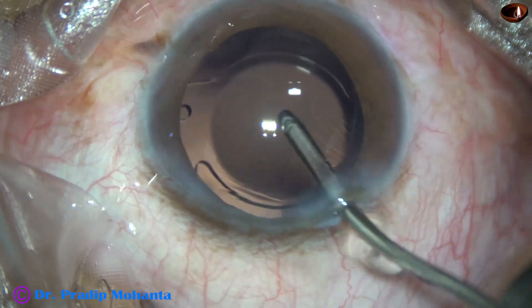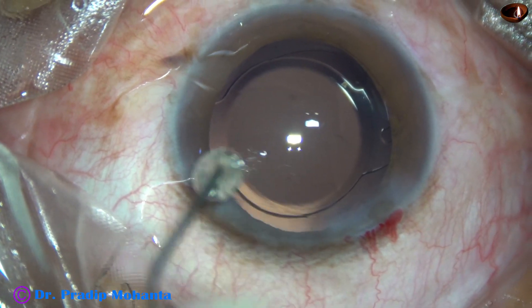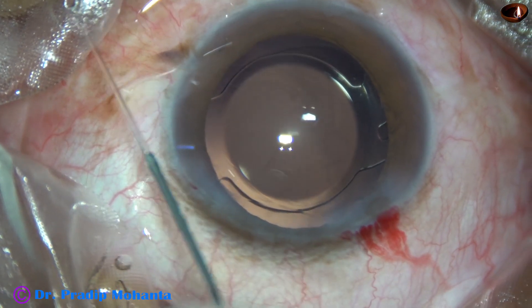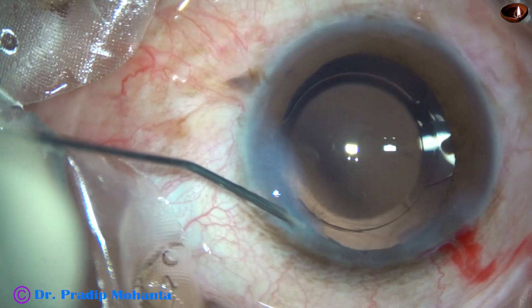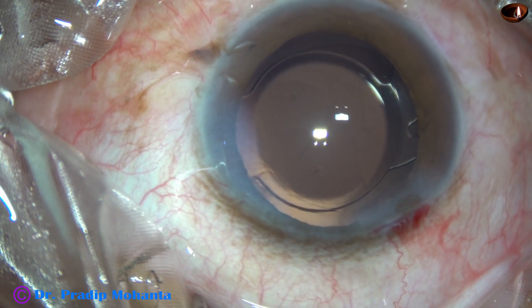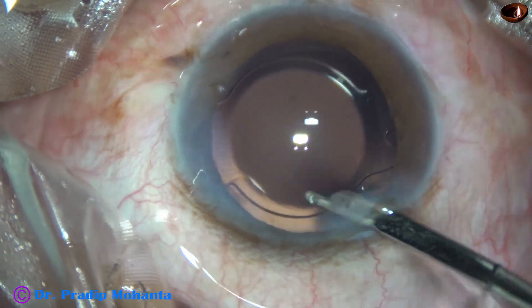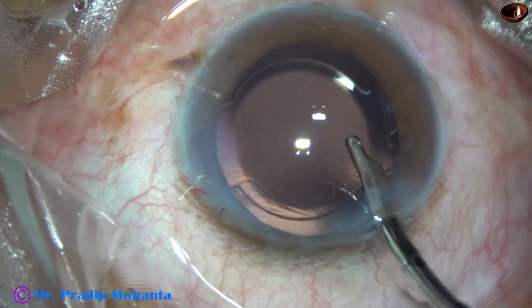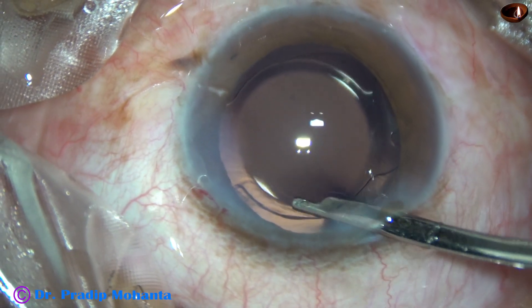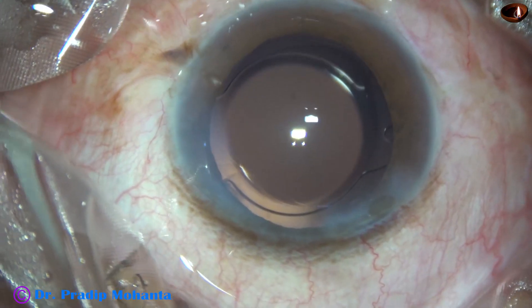This is a real-time surgery and the aim of this video is to show you that we can be quick while at the same time being meticulous and very safe for the patient. It is always advisable to use the minimal time required for meticulous surgery. Minimal time you stay in the anterior chamber for a meticulous job. If you spend a lot of fluid and a lot of time in the anterior chamber, endothelial cell loss is going to occur and you will not have a clear cornea next day.